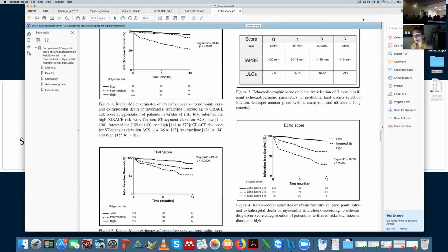And I think it can also be a prognostic factor in these ischemic patients, because of course if you have a patient who has wall motion abnormalities but is used to that and doesn't develop pulmonary congestion, it's much safer somehow. If you have a patient who has acute ischemia and also acute pulmonary edema, those patients are very bad.